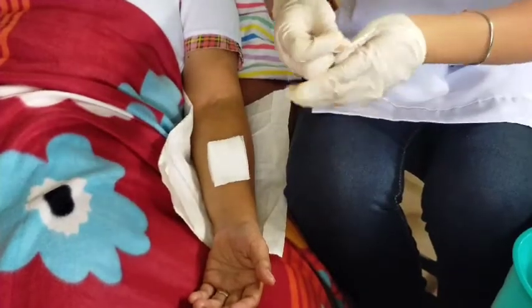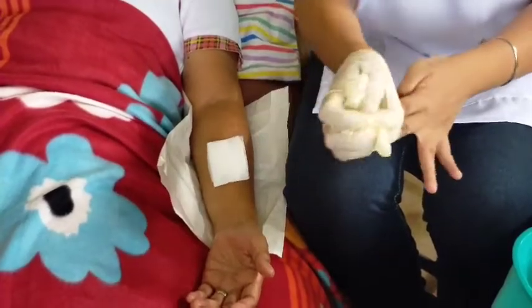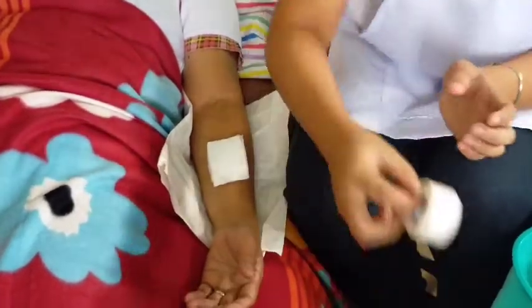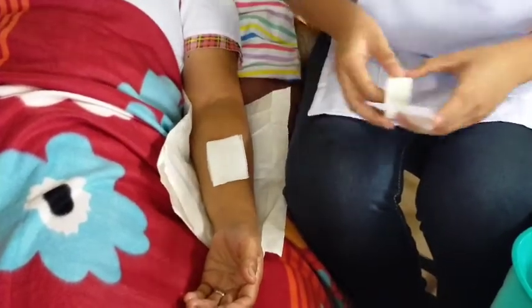Now, we can remove and discard gloves. And we're going to apply tape to secure the dressing.